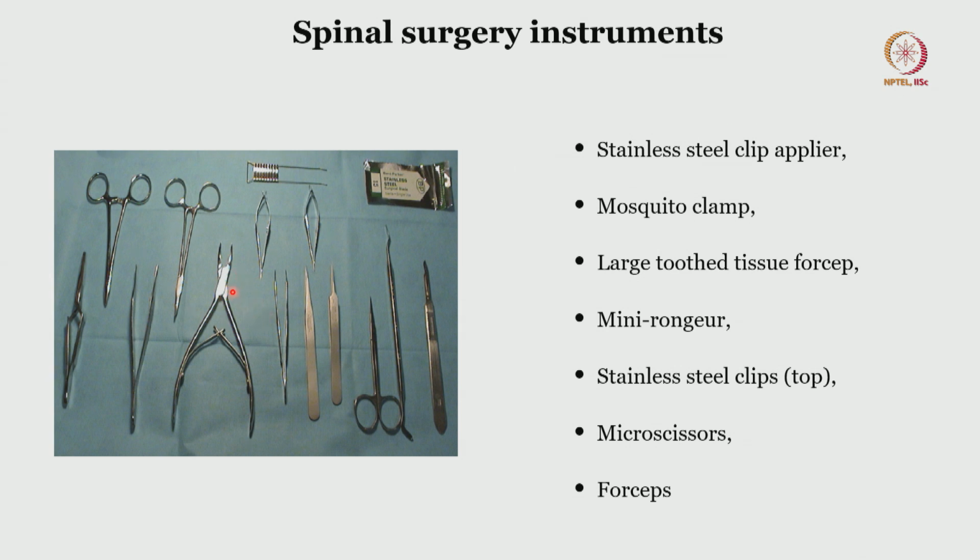When you use this instrument, obviously the entire spinal system will move along with your force to remove the bone. That's exactly why we need a stabilization setup where the spine is fixed at some point, so that there is a counter traction on the rodent body when you remove a segment of the spinal canal.